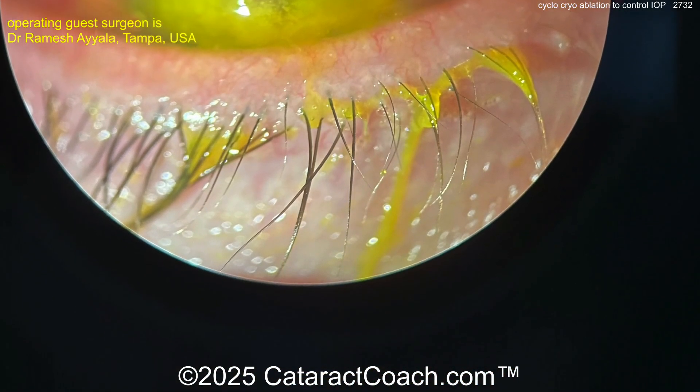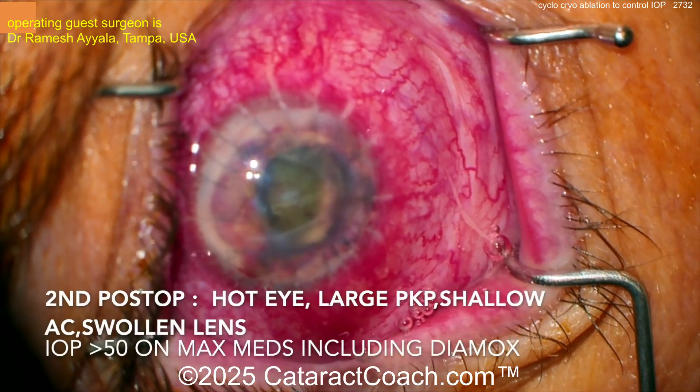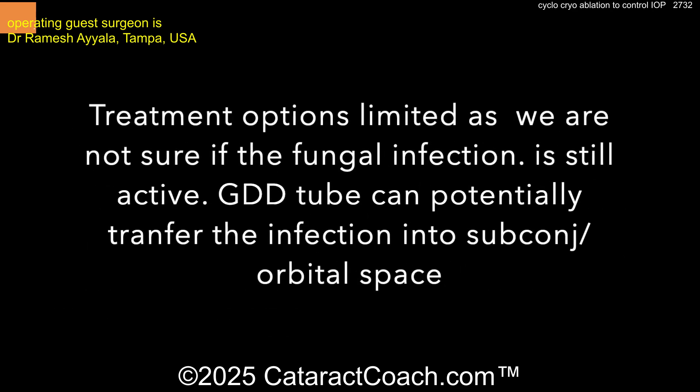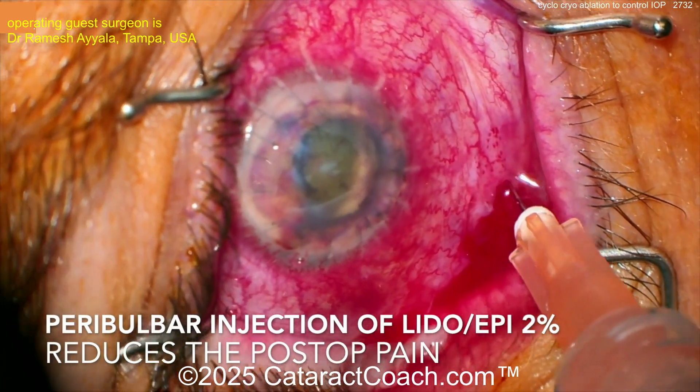It's really quite bad actually. And the catch is, you don't want to do an intraocular procedure lest you get infection inside the eye. You can see a big PKP has already been done.